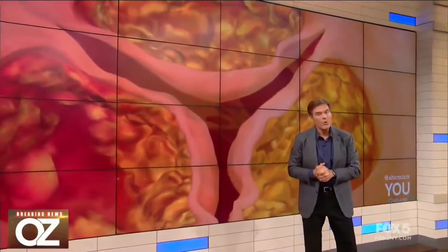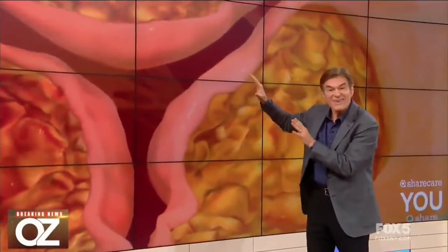So about 2 decades ago, 2 innovative engineers and 2 cardiologists had an idea. What if we could fix this problem with only making a small incision in the groin and replace this valve with a catheter instead of using that saw that I used earlier? They asked me to help design the device, and now a new clinical trial, all these years later, suggests that this treatment, now called TAVR, T-A-V-R, may become the best option for everyone. And I want to introduce you to my friend, Dr. Marty Leon.